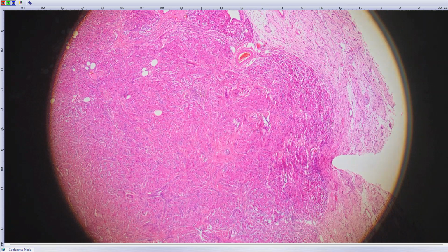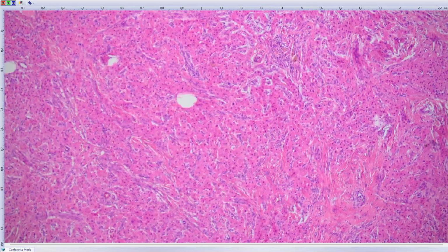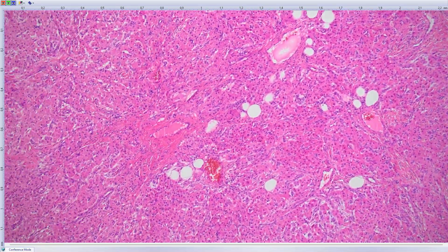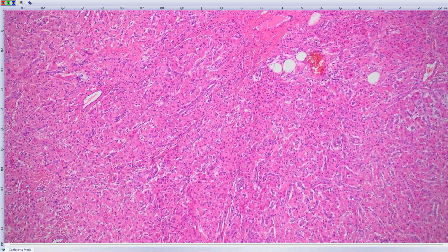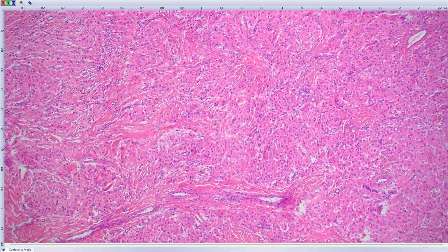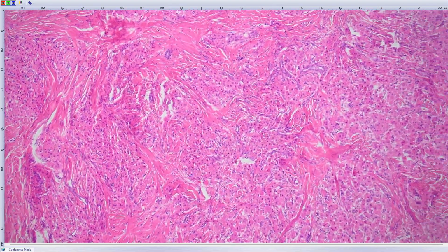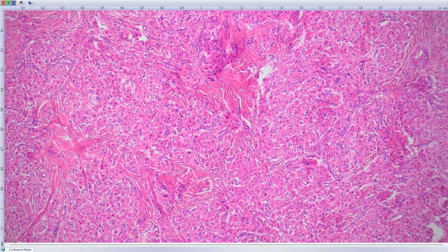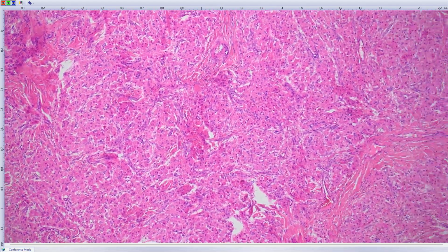adrenogenital syndrome. These lesions are not genuine tumors, these are tumor-like lesions, and they are very similar to Leydig cell tumors and occur only in men who are improperly treated or who are not yet diagnosed with adrenogenital syndrome. Otherwise, clinicians don't undergo biopsy for treated and controlled patients. But if we have a patient with tumor of adrenogenital syndrome, we can see something, as I said, similar to Leydig cell tumor, but there are some aspects which are different.